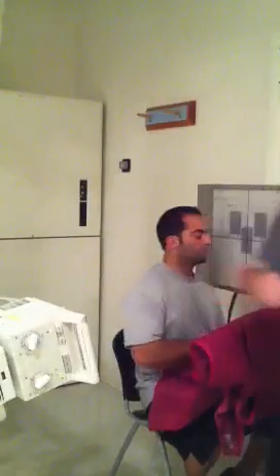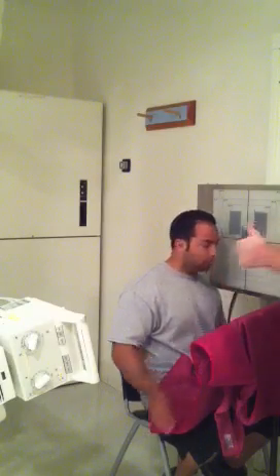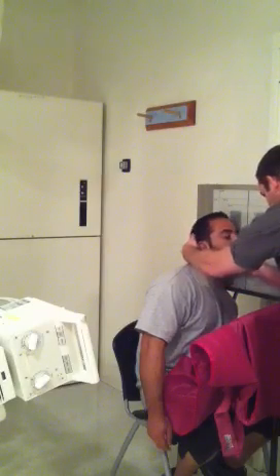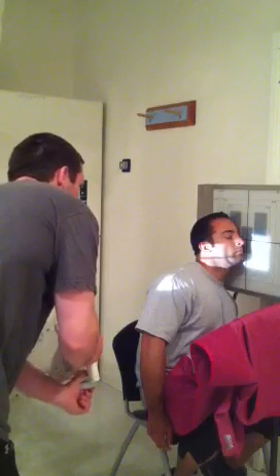For this next one, we're going to be doing the axial lateral oblique of the mandibular symphysis, or body — we'll do the body. Stay in position and bring your chin inward. For the axial lateral oblique mandibular body, the midsagittal plane is rotated 30 degrees to the IR from true lateral, and the angle is still 25 degrees cephalid directed to the area of interest, which is the mandibular body. We're collimated, have the marker and shielding, and we'll shoot it at 70 kVp and 12 mAs again.